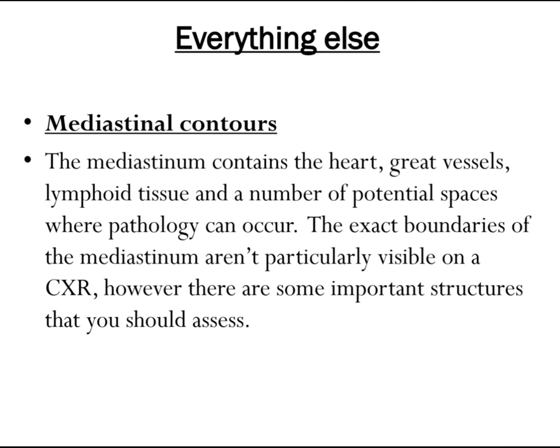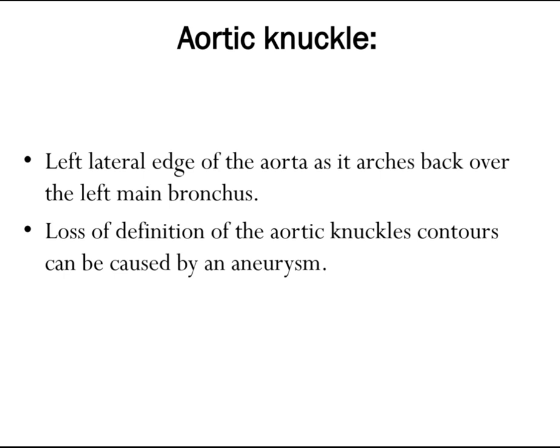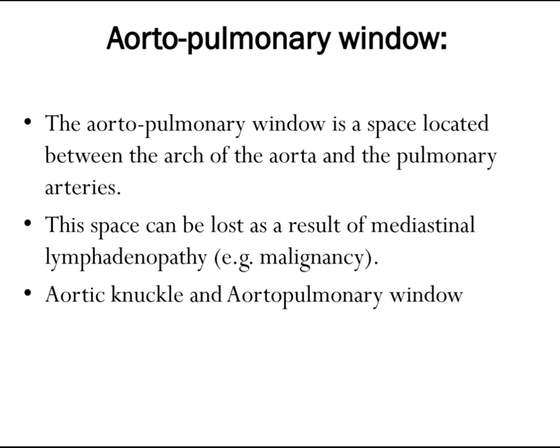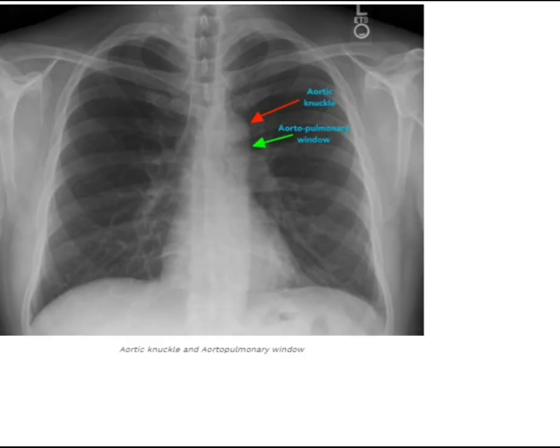E is for Everything else. Take note of the mediastinum contours. The mediastinum contains the heart, great vessels, lymphoid tissue, and a number of potential spaces where pathology can occur. Important structures to assess include the aortic knuckle — the left lateral edge of the aorta as it arches back over the left main bronchus — where loss of definition can indicate an aneurysm. The aortopulmonary window is a space between the arc of the aorta and the pulmonary arteries; this space can be lost as a result of mediastinal lymphadenopathy or malignancy.